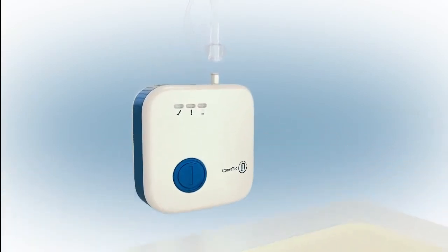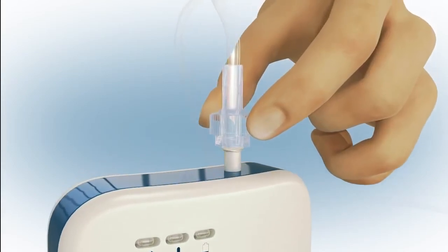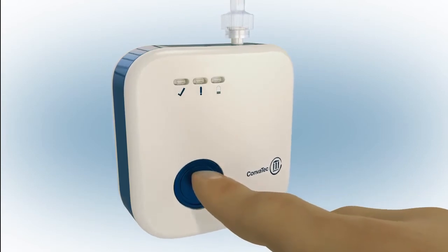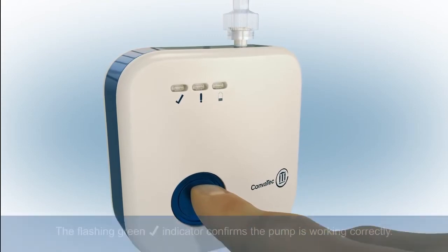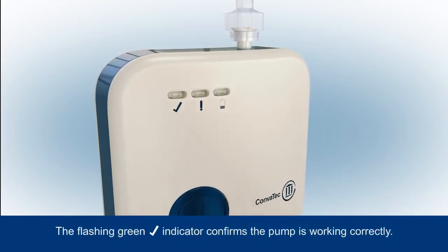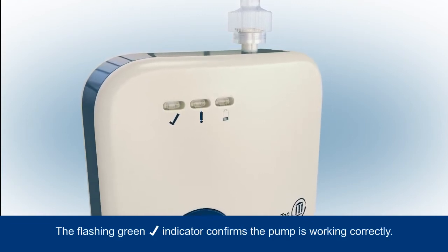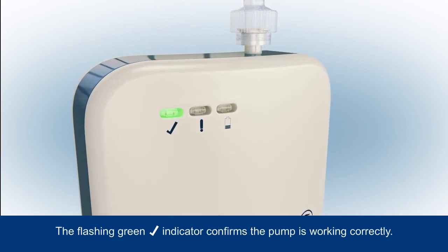If a shorter connection is required, the pump tubing can easily be removed from the pump, and the dressing connected directly to the pump. Press the blue button at the front of the pump for 3 seconds to commence negative pressure. The green tick indicator will start to flash to tell you the pump is working correctly and will continue to flash regularly to indicate that the system is turned on and functioning properly.